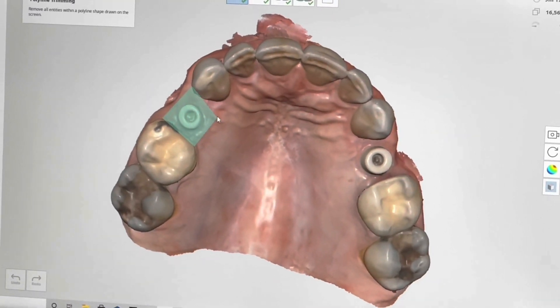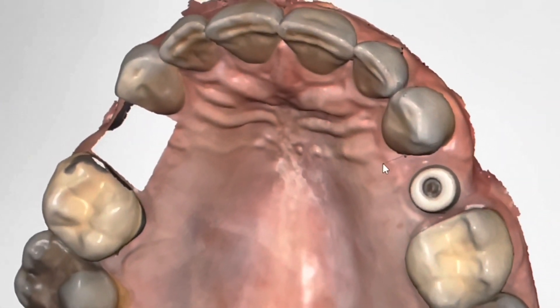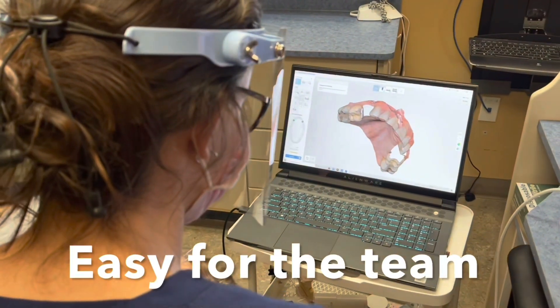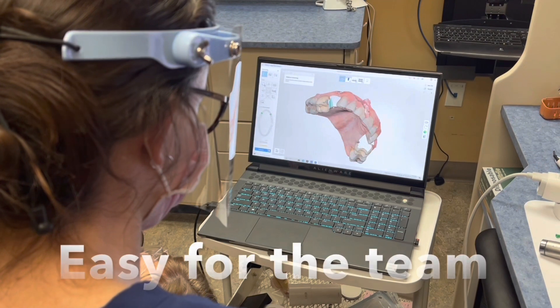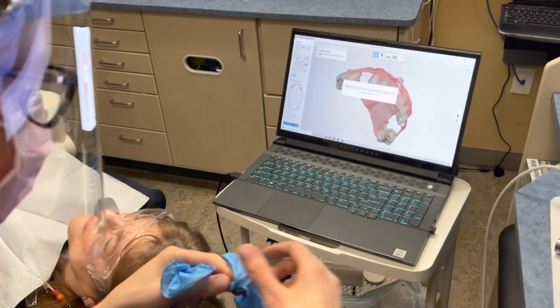What you can see is that we're going to cut these original scan bodies. So these are scan bodies from the On1 system. We're going to cut them off the scanner and then add the new crowns that we just put in this morning. And so these new crowns are in position.